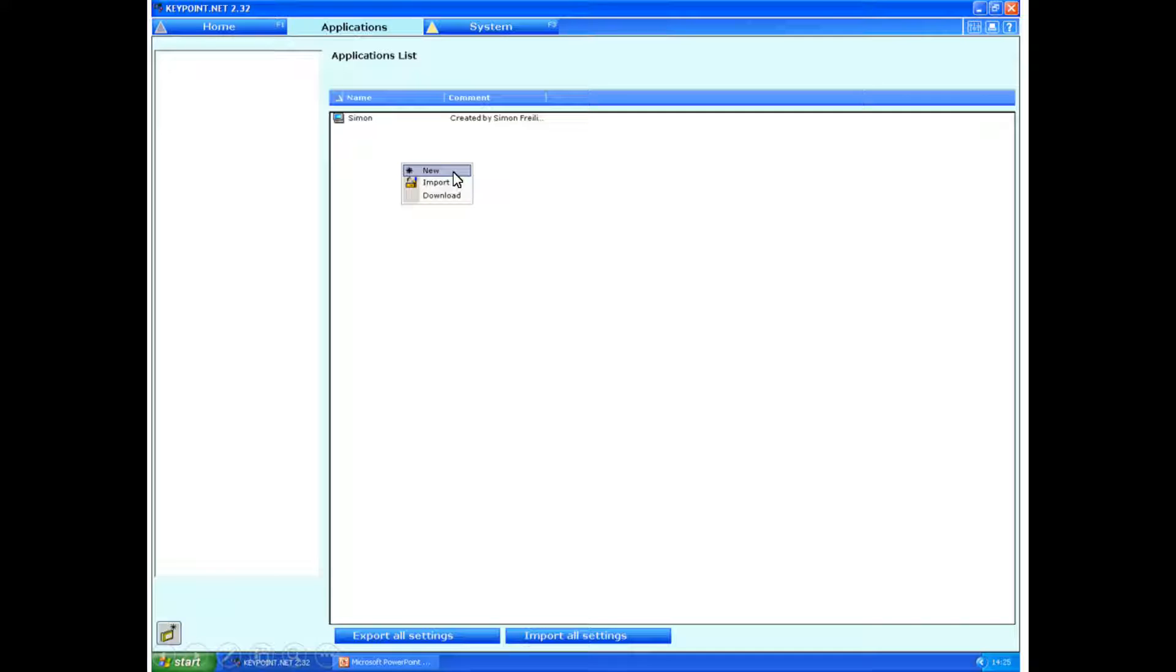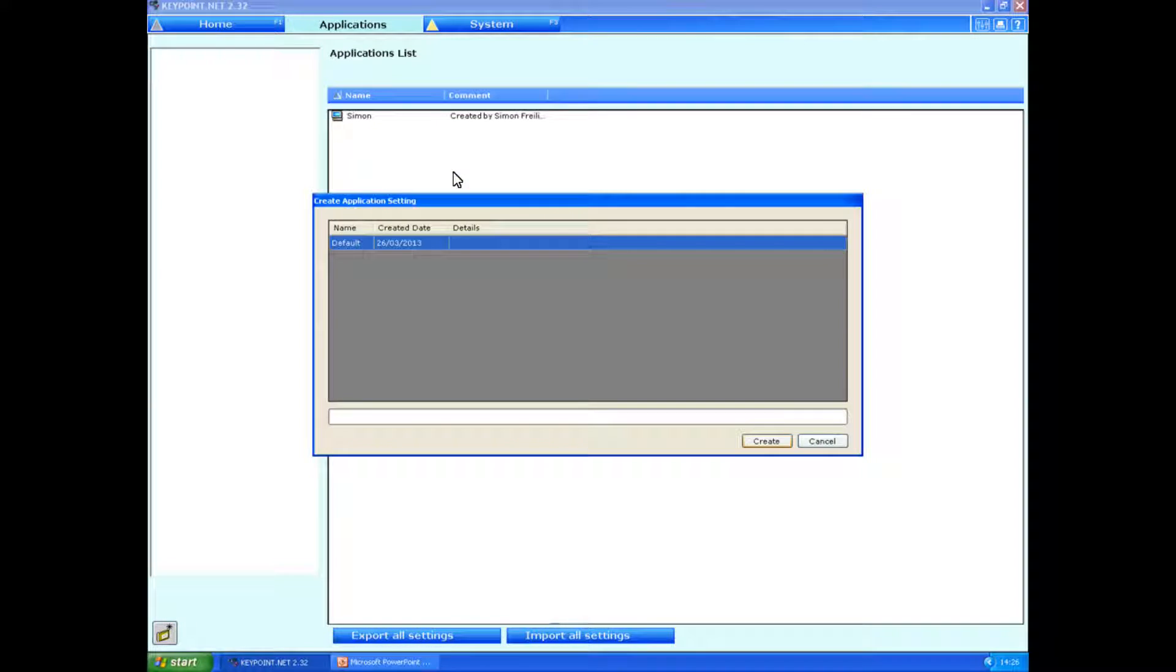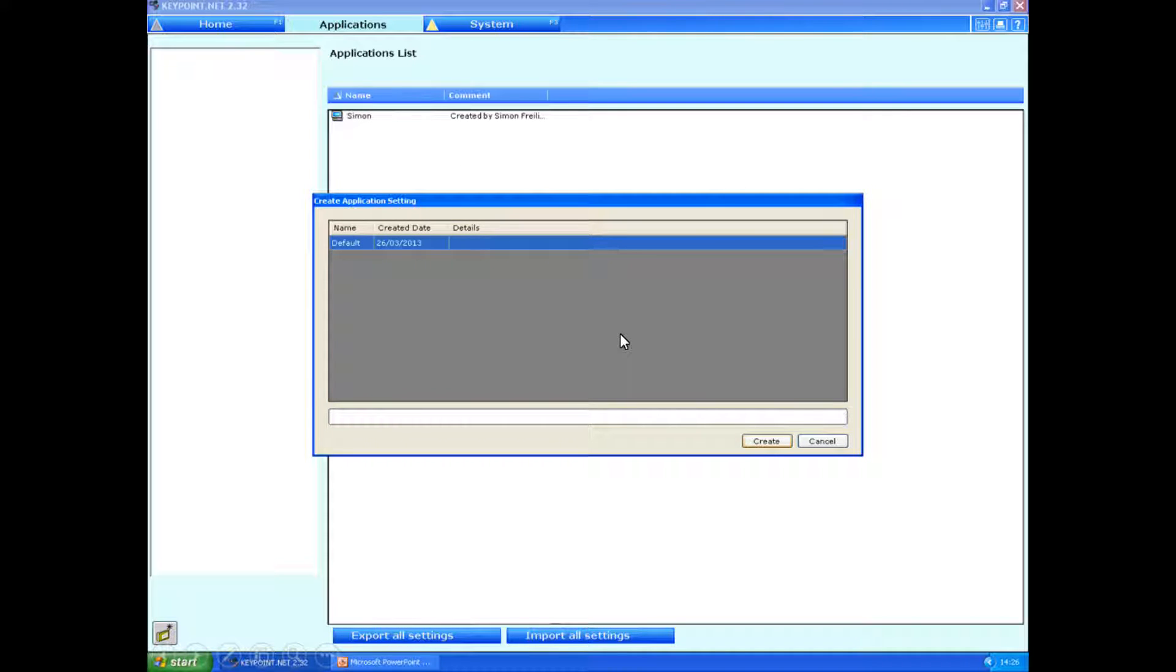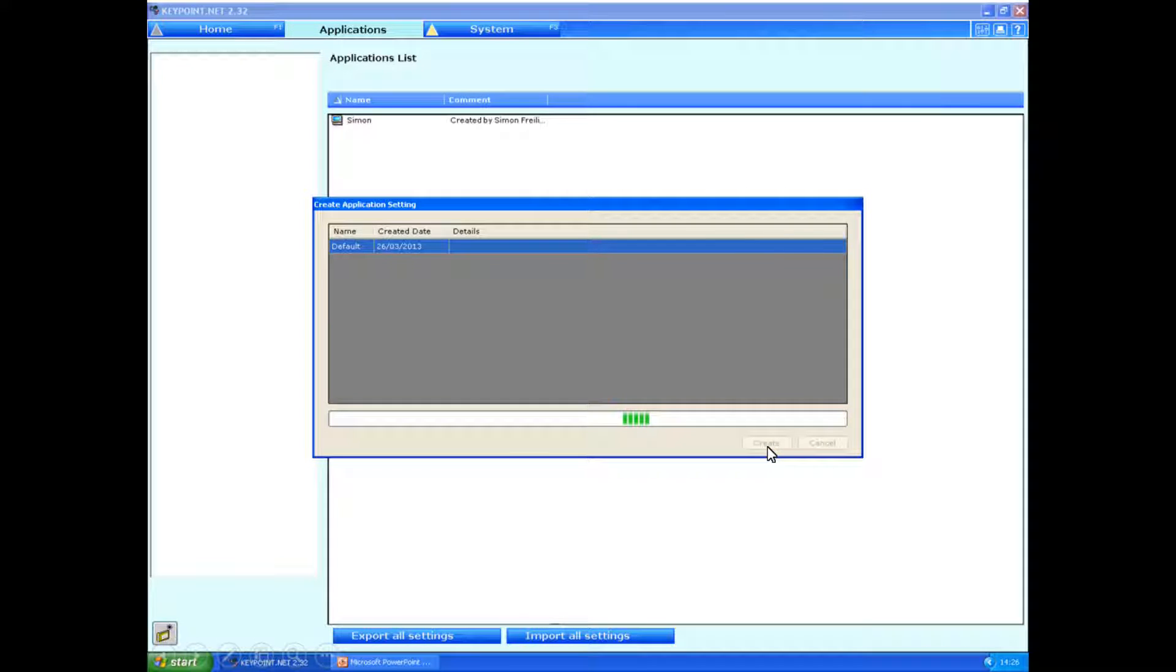This will start up your own personal application. In the create application setting, you don't need to press anything other than create at this point. It might take several minutes to get going.